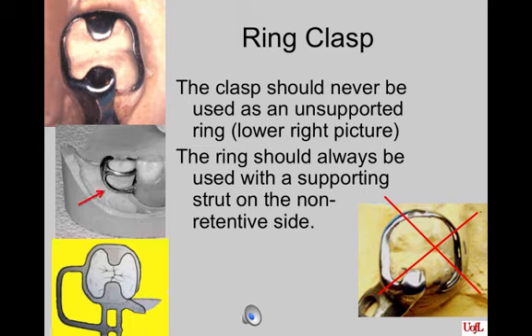with or without the auxiliary occlusal rest on the opposite marginal ridge. It recommends an additional support provided from a bracing arm that originates from the minor connector, runs parallel to the gingival margin, and then ascends to the reciprocal component. It states that this strut aids in reciprocation and stability and is really not available unless the support is used. We have done several of these and do not always place that extra supporting strut and have not really had any problems with it. We do always place a mesial and distal rest on the ring clasp.